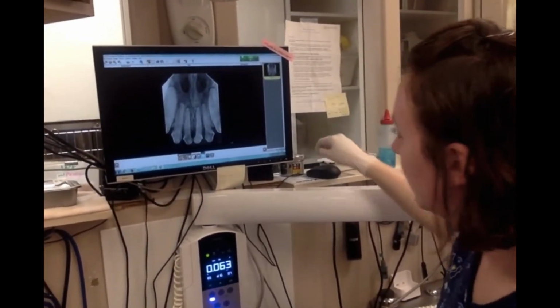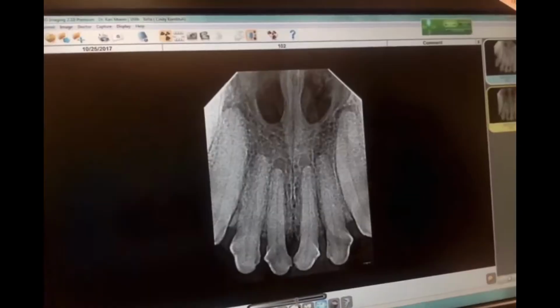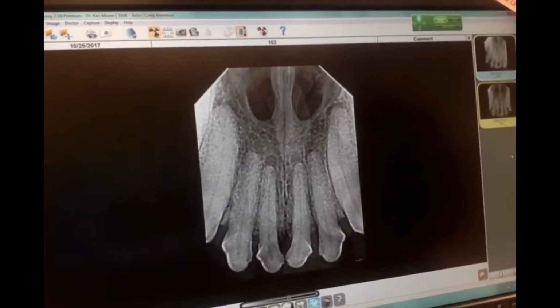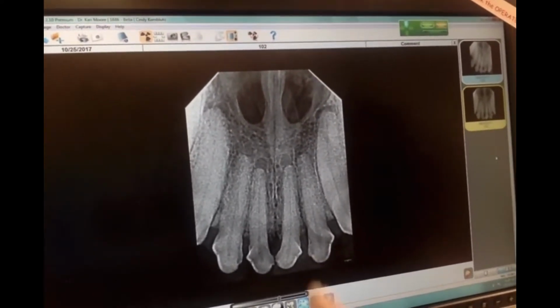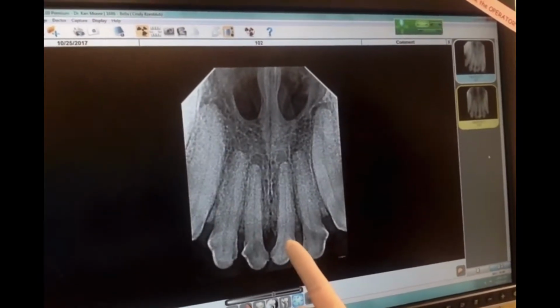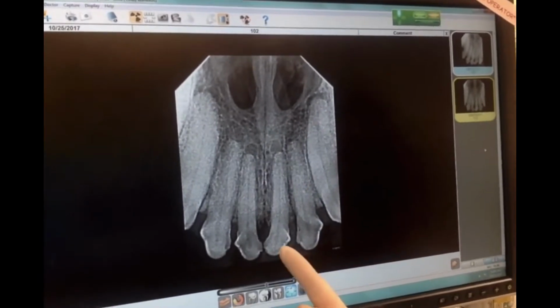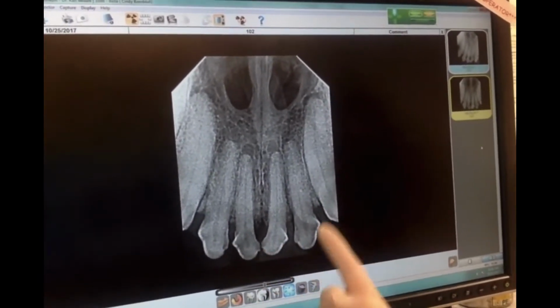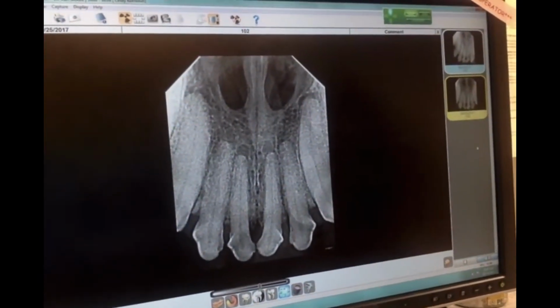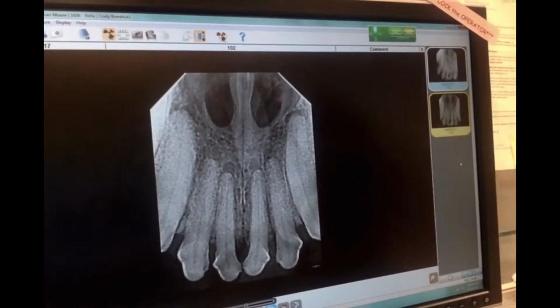All right. So we can zoom in a little bit here on that image. So this is a good shot of those upper incisors. Everything's going to be a little flipped on our radiography screen, so this is actually the left-hand side. We got a good shot of these 4 upper incisors, 101 and 102 and 201 and 202. We got the root tips here of 103 and 203. We didn't get all of the crown in, but this is a nice diagnostic image if the doctor needed to look at just the root tips.